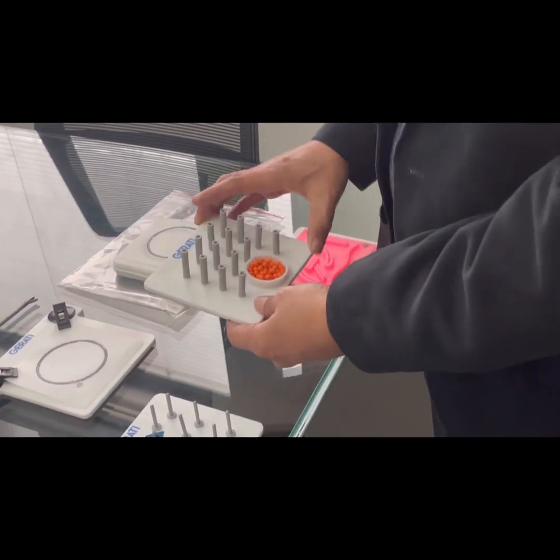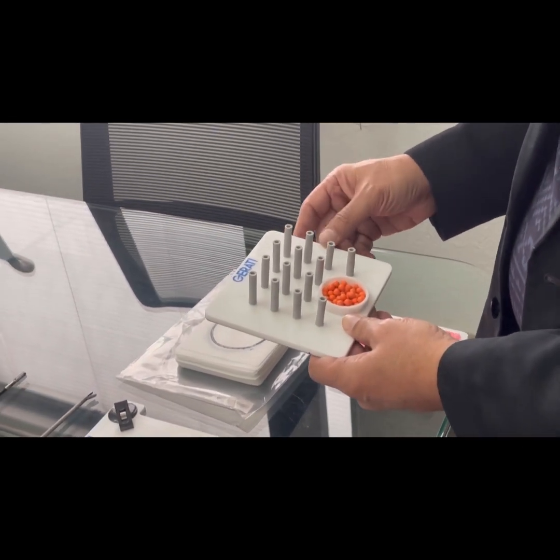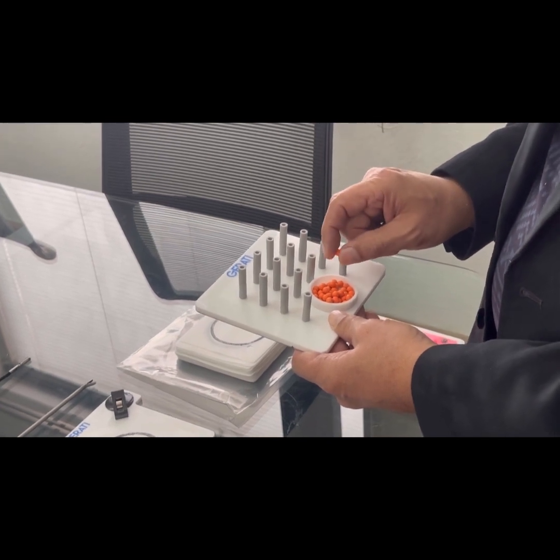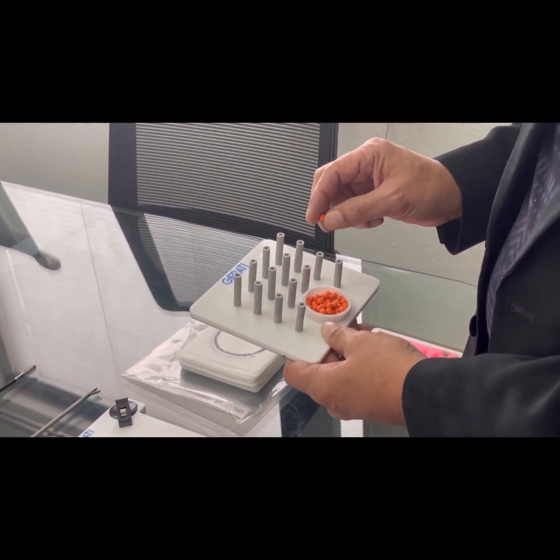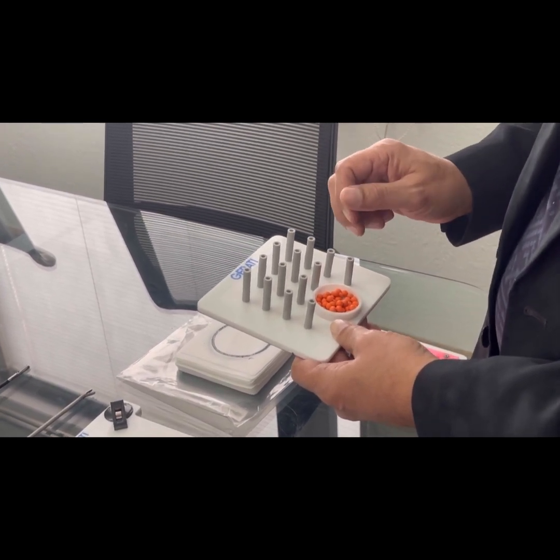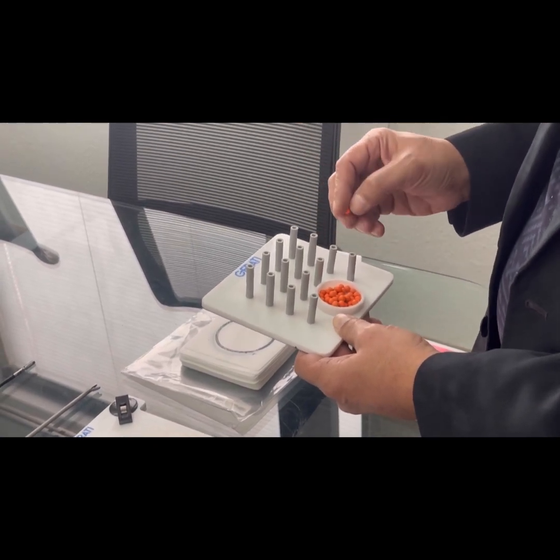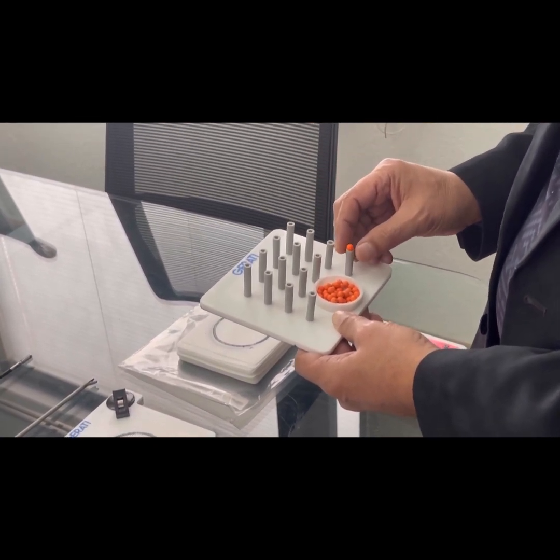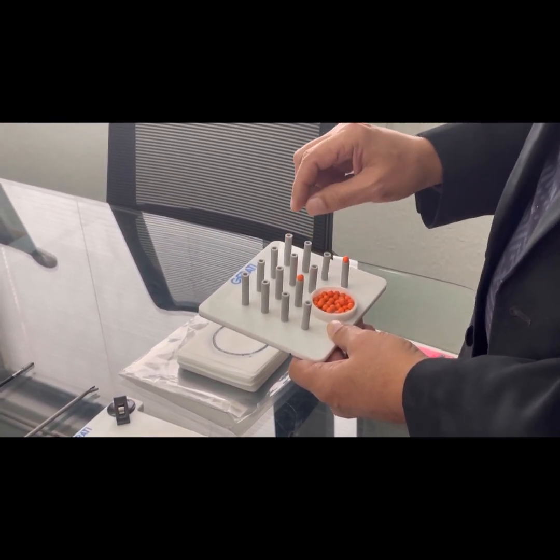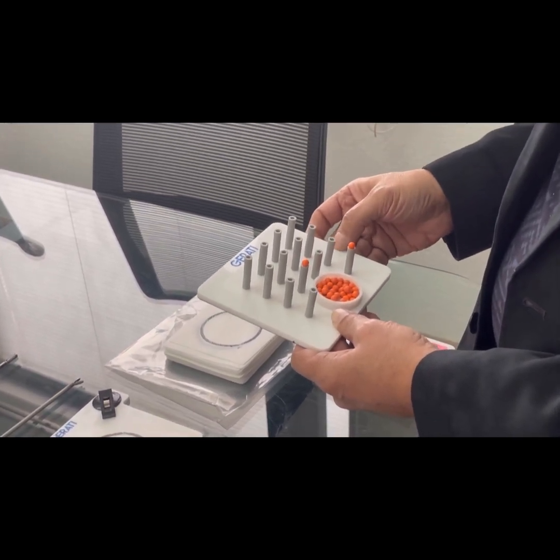The bead placement task requires the user to pick up small beads using laparoscopic instruments such as a grasper. This exercise helps with dexterity improvement. The right two lanes are filled using the right hand and the left two lanes using the left hand, helping develop training for the left hand as well.